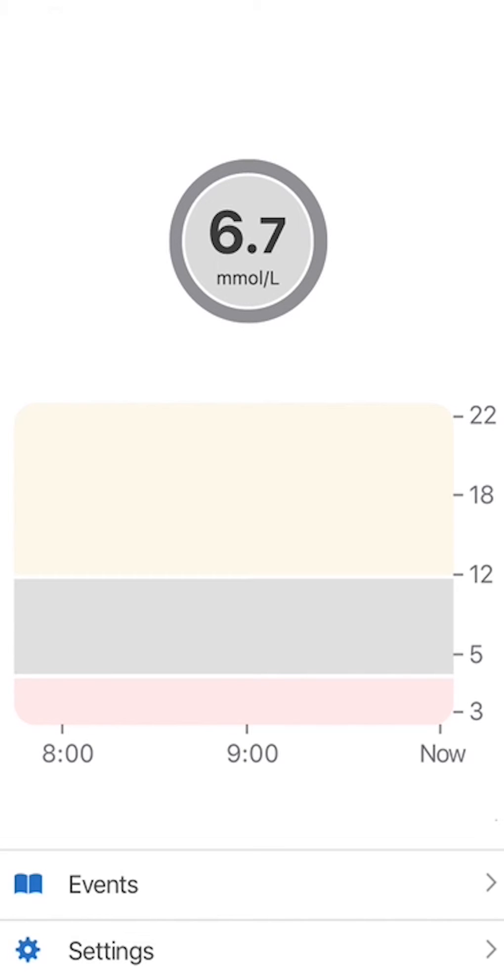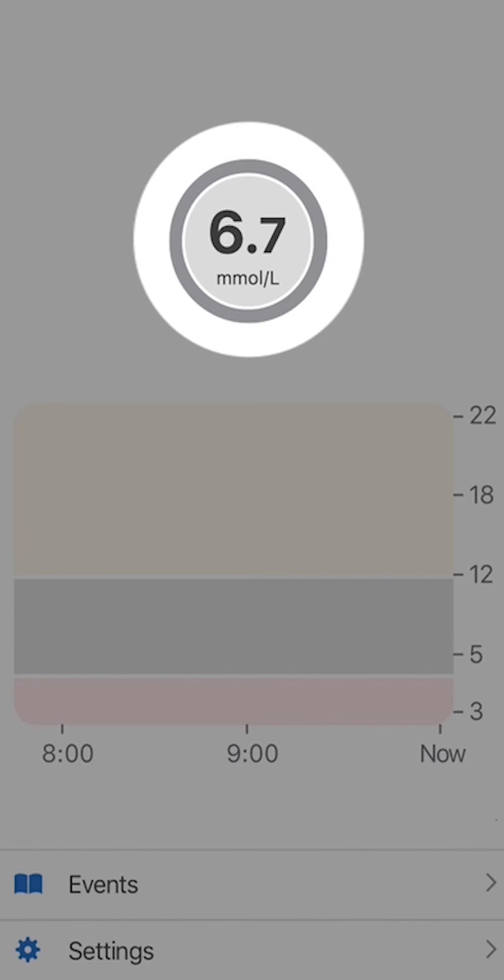See the number in the grey circle? That is your sensor glucose reading. It updates every 5 minutes.